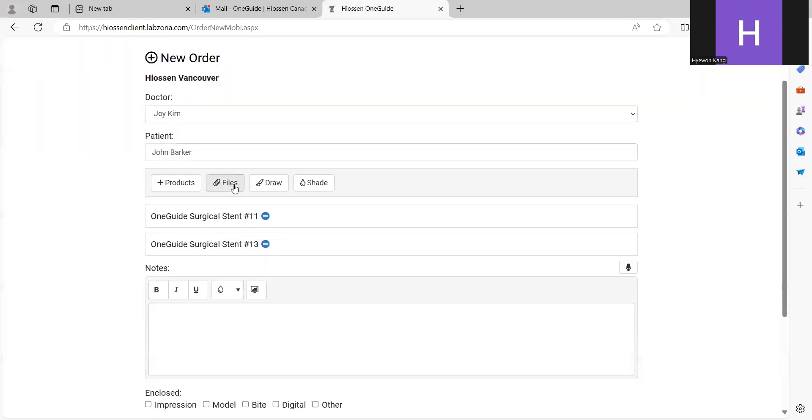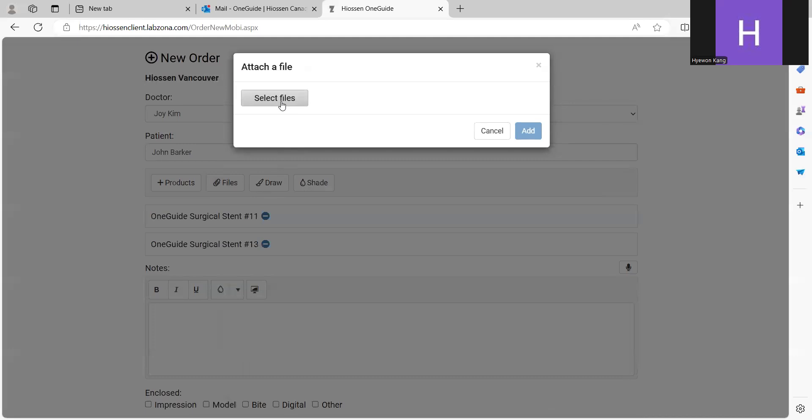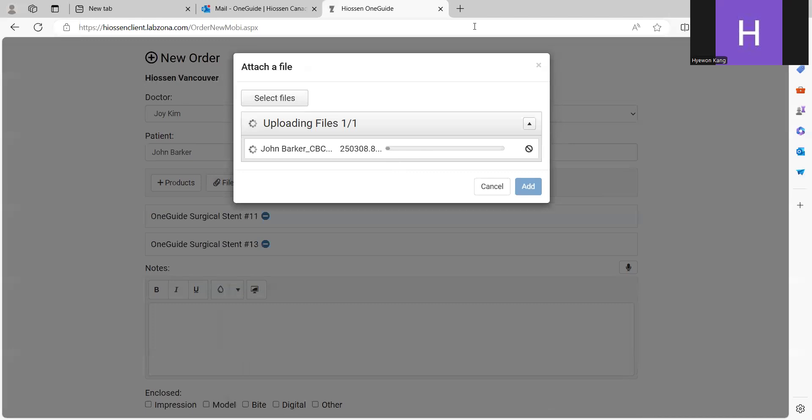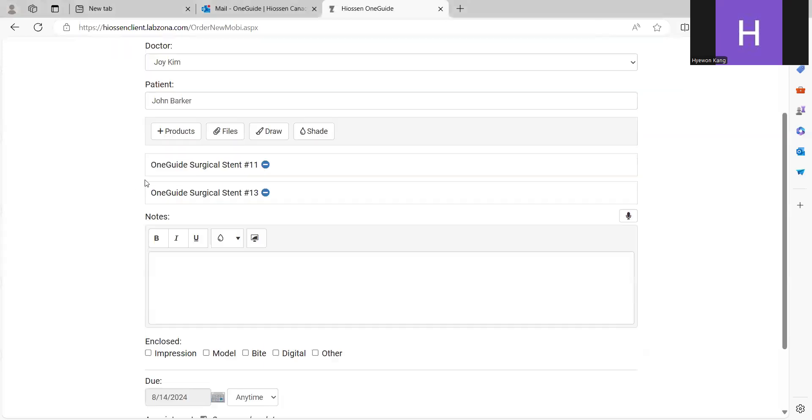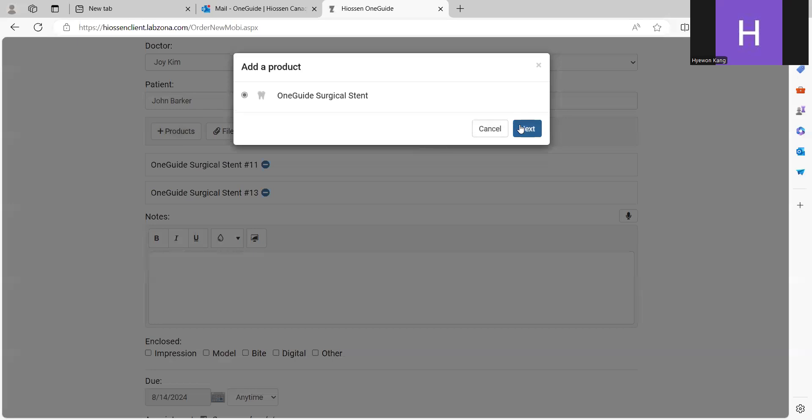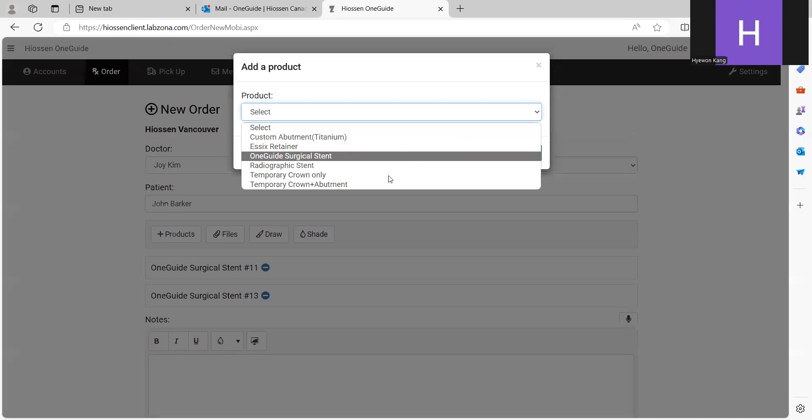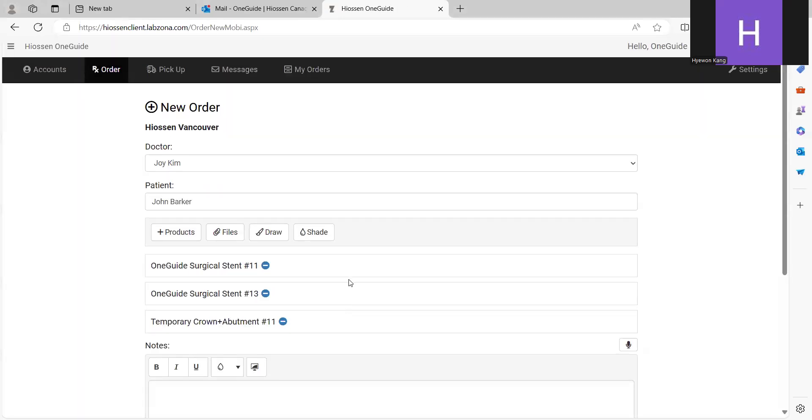And then you can attach the file from this menu. Select file, CBCT. And then you can also add some products if you want to place the order for the temporary crown as well. You can select the temporary crown abutment products, the tooth number here.